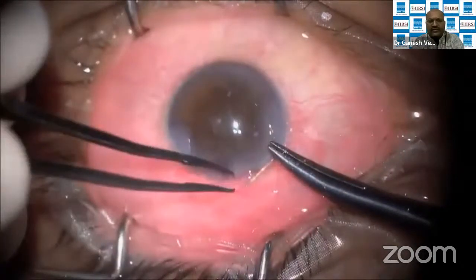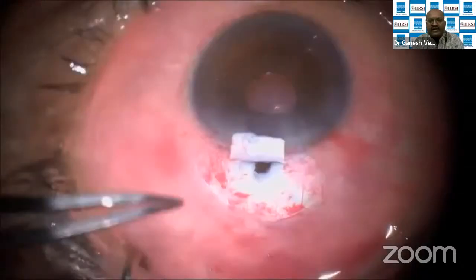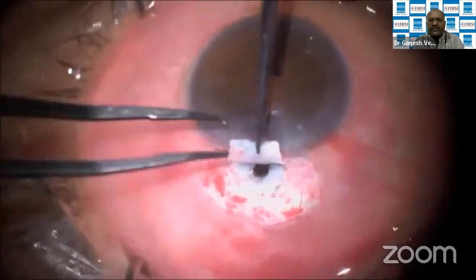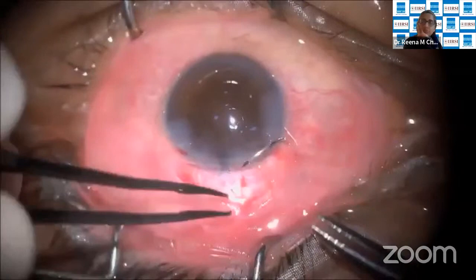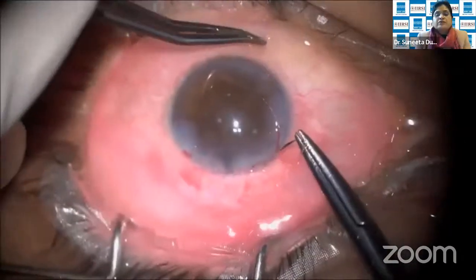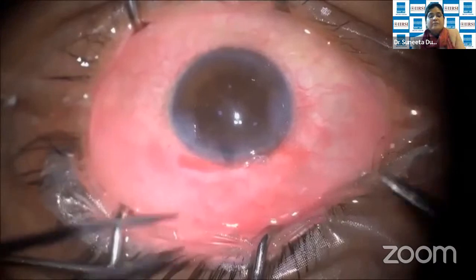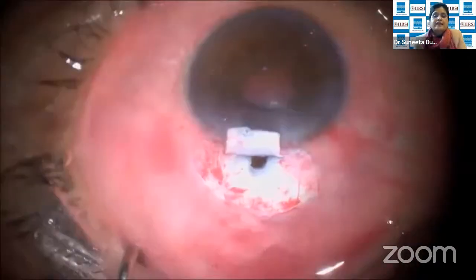We can just show that the important thing is that the edge of the punch should be at least 1 millimeter from the edge of the flap. The distance between the edge of the flap and the edge of the punch should be at least 1 millimeter. That's the point, so that you don't have overfiltration. That's very, very important, and it's very nicely demonstrated here. As far as possible, it should be in the center, because if it is eccentrically placed, then there will be very less resistance to flow on that side.